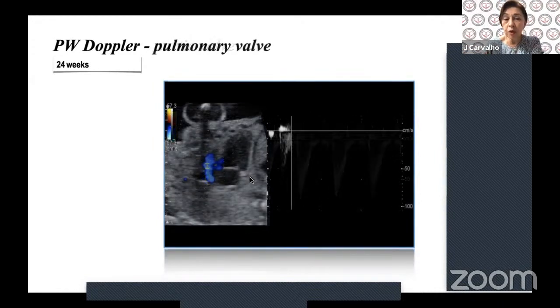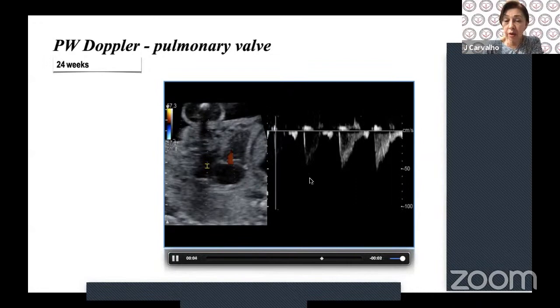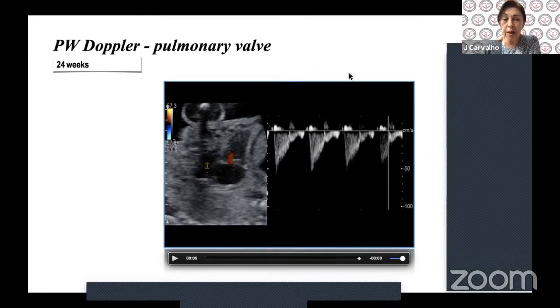So of course we have to move. And this is for more or less a sagittal view, where the left ventricle is here, the right ventricle coming through here. So now we are at almost 0 degrees to the pulmonary outflow tract. So we get the highest velocity and the most accurate velocities. So very important to keep this in mind too.